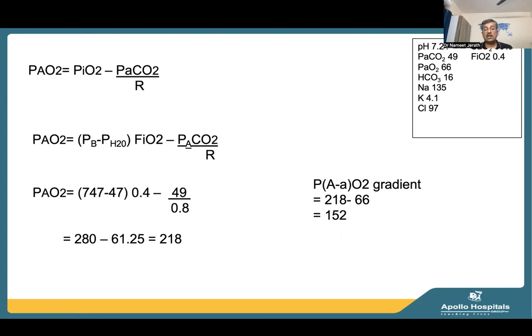So an alveolar arterial gradient of oxygen which is this high basically tells you there is a parenchymal pathology happening simultaneously. And that is one utility of oxygen, or PaO2, in the arterial blood gases. For most of the other routine uses in the intensive care units, your SpO2 works as well or probably better than your PaO2 in the arterial blood gases.